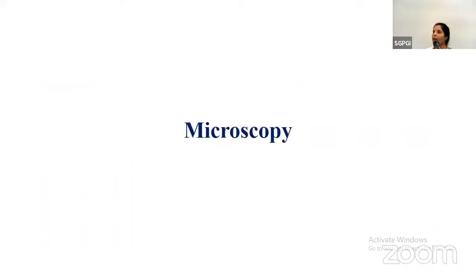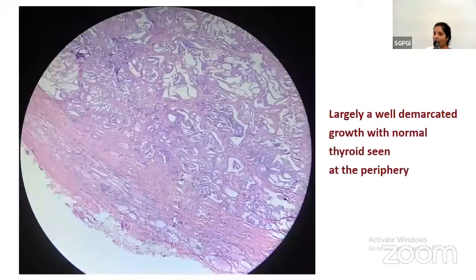which was later reported as a parathyroid adenoma. So just to make this session a little interactive, I would be showing the pictures of the histopathology slides, and I would really love to have your inputs on that. And slowly and steadily, we will proceed toward the diagnosis.